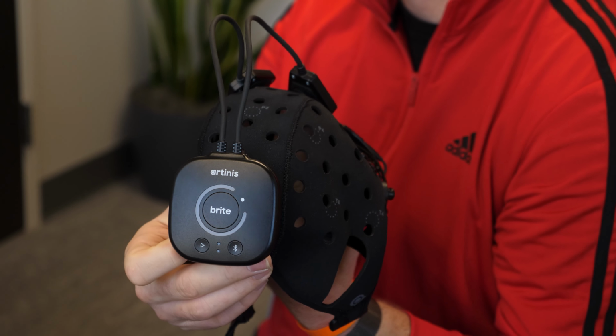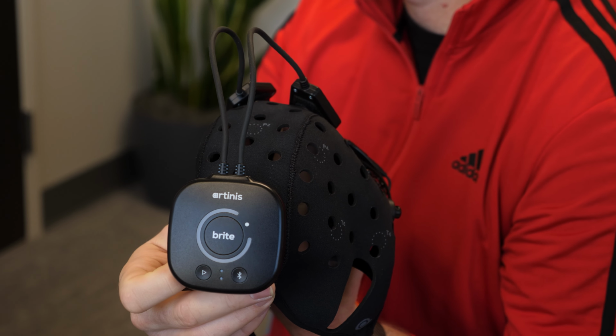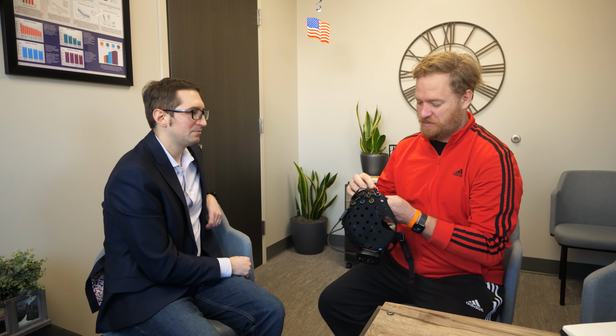And then it's all on board, like all the recording is on board? For this system, yes. That's very cool. It connects with Bluetooth, and theoretically, this particular system, you could take to a grocery store, and we could have a little button that says, here are the events we want to measure, and then take it back to the computer and look at the data. That's wild. Please. Can I try it on?